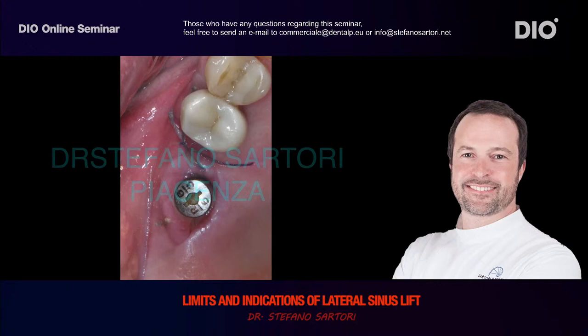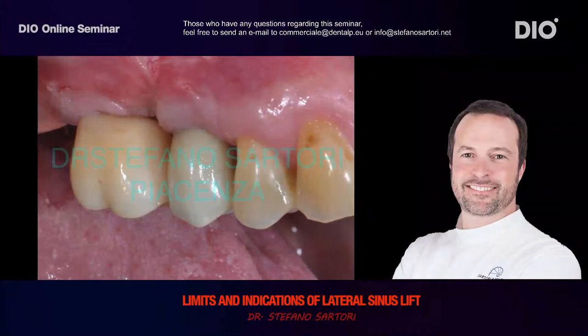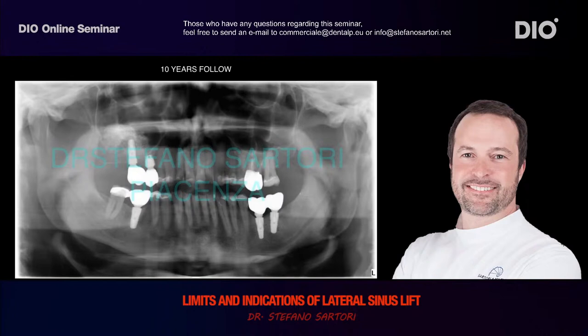And this is the finalized case. But look at the buccal view of this case. Look at these 2-3 millimeters of keratinized tissue that stabilizes the tissues around the implant and make more easy the oral hygiene procedure. Next slide, you can see the X-ray after the healing and the follow-up after 10 years.